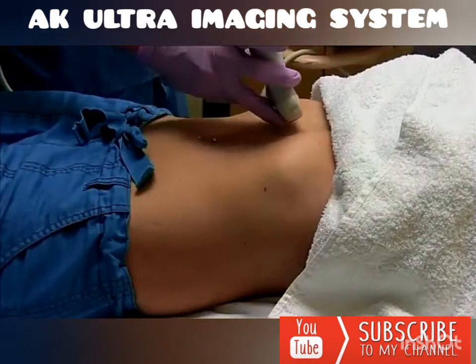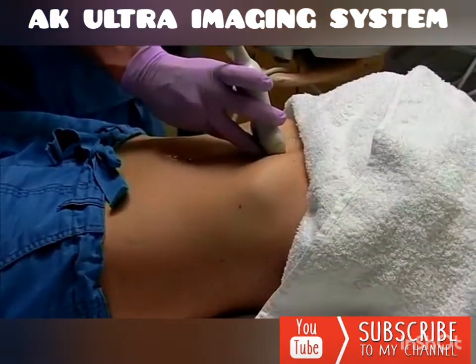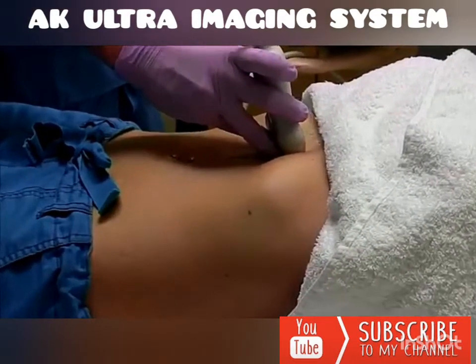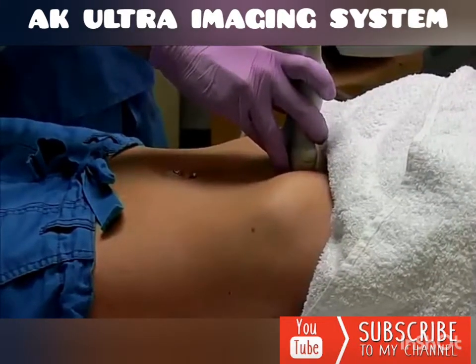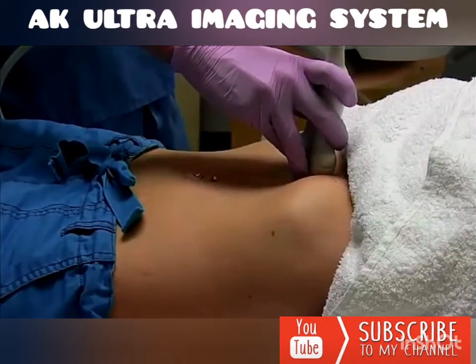To image the pancreas, which is what we're going to look at next, you want to come subxiphoid again, and what I would do is come up high and angle down. That way you're using the tip of the left lobe of your liver as your window.